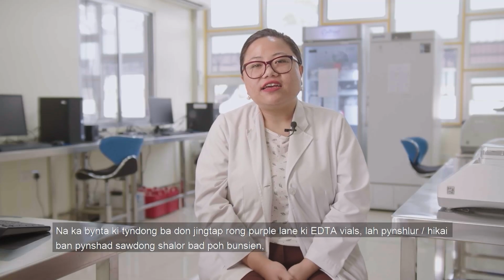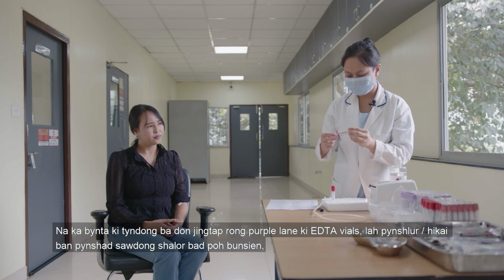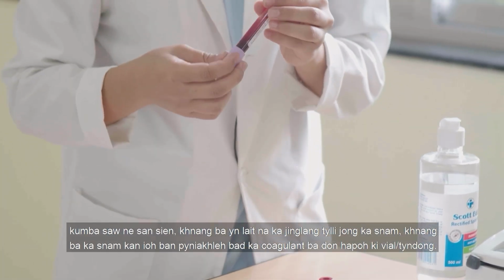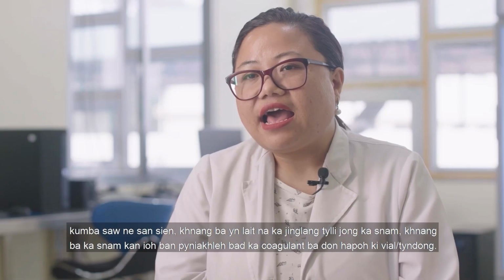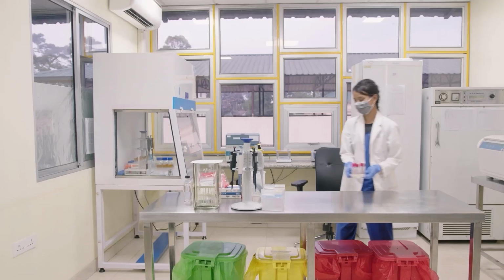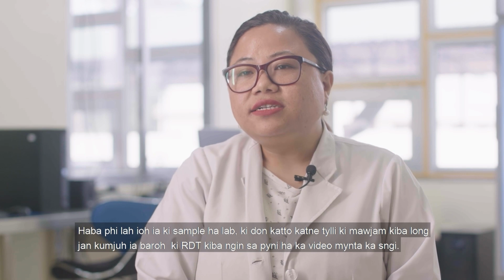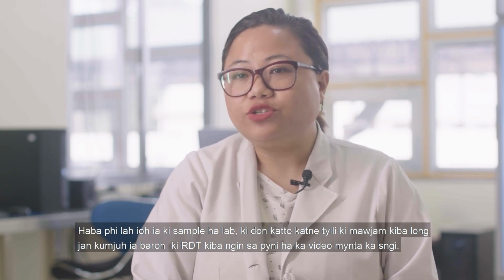For an EDTA or purple colored Vacutainer vial, it is advised that you rotate the vial upside down multiple times, up to 4 to 5 times, in order to prevent coagulation of the blood, so that the blood can mix with the anticoagulant that's present in the vial. Once you receive the sample in the lab, there are certain steps which are common to all of the RDTs that we are going to be showing in the tutorial today.